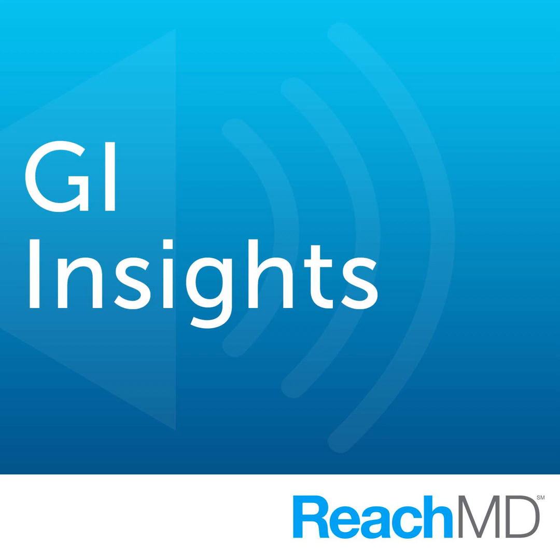Similar to what the STARDUST sub-study suggests, using ultrasound to drive a treat-to-target strategy, I think is going to be very revealing and helpful. We're doing a study now like that, but we're also using ultrasound to characterize ulcerative colitis as a transmural disease. We have realized that although traditionally we talk about ulcerative colitis as a mucosally limited disease, actually we've come to realize that it actually is transmural more often than not, and it impacts on response to therapy. So ultrasound is a way to measure that and to document response to treatment and whether it improves outcomes.